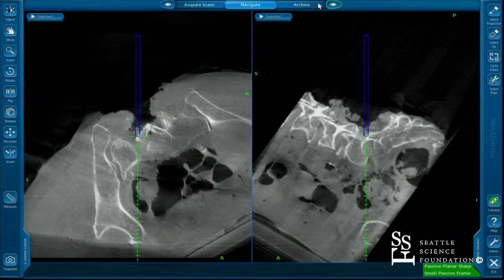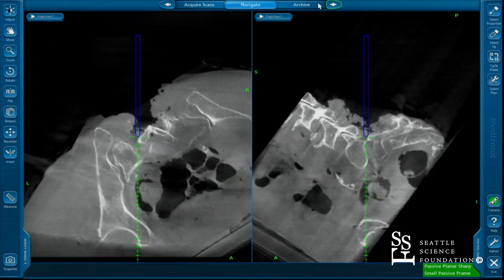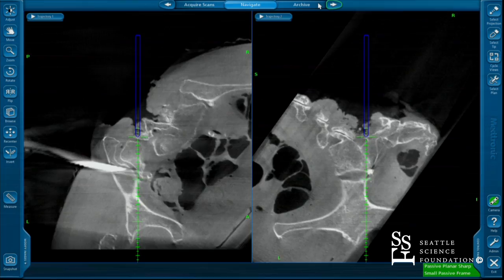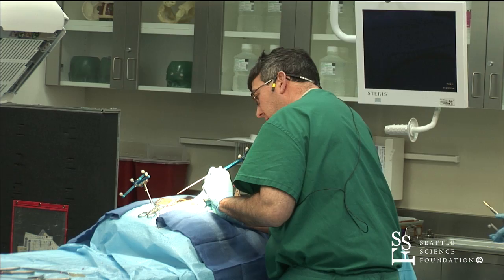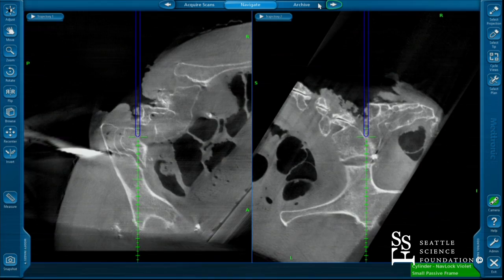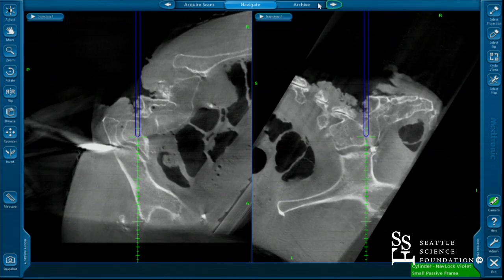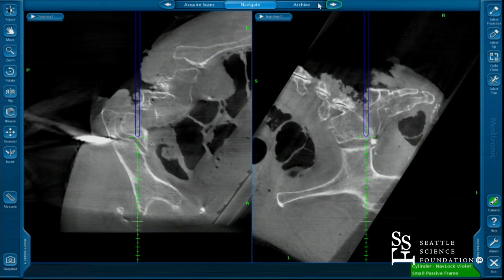So how about putting an alar screw for us very quickly — we have three minutes. All right, ready? So I mark it and I go, okay, what's my ideal trajectory? That looks pretty dang good. So I take my screw, then I would use my awl and I would say, okay, here's my awl — do I like my trajectory? And I would just go right down. And you can see I'm feeling my way down. You still use all your own tricks — I can feel I'm hitting the S1, I can feel myself hitting the sclerotic bone or the cortical bone. And you can see I'm going now through to your SI joint right here. Tapping down.